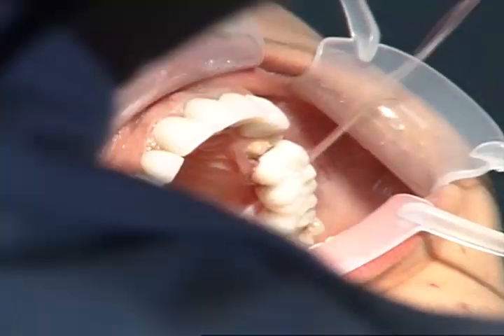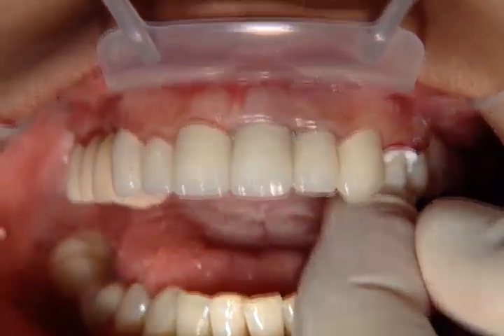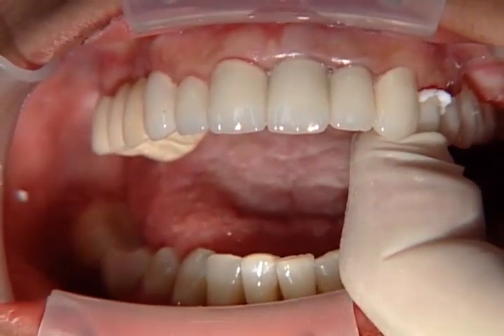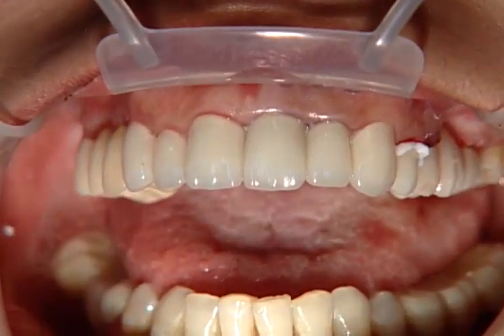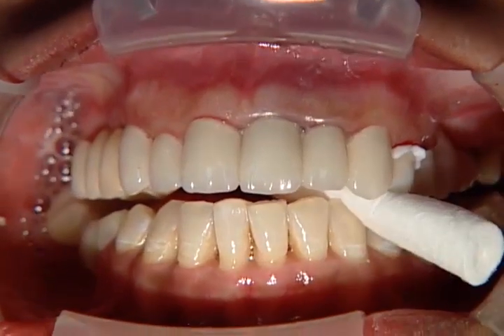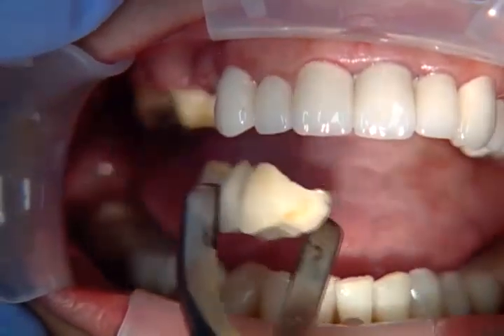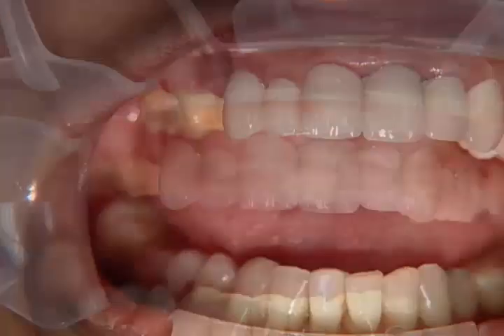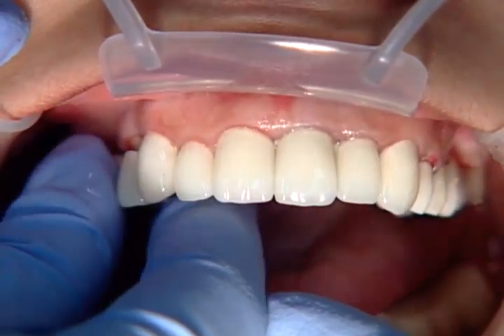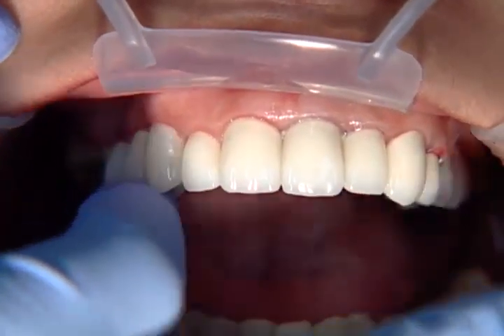So we can push things into place and have patients bite down on cotton rolls and do all kinds of things. We really do treat these just as though they were a PFM. And that's why I'm showing you this with the patient biting down on it. You can treat these as you can a PFM. That is not necessarily true for other all cementables, but I can say that without reservation for the zirconia restorations like clinical zirconia. You can really treat them like PFMs, put them in, have the patient bite down, check the bite, have the patient bite on a stick or a cotton roll during cementation. It is okay for you to treat them like they were actual PFMs.